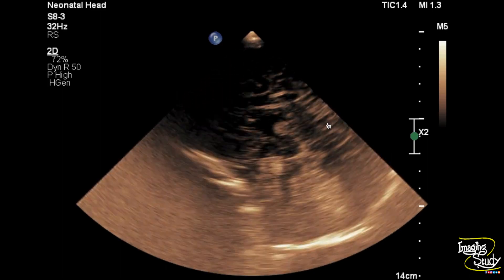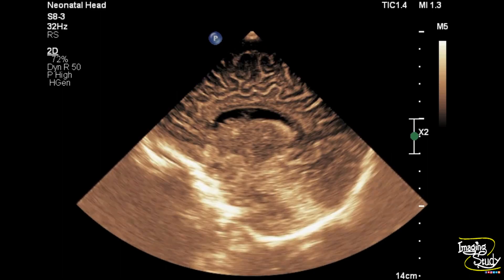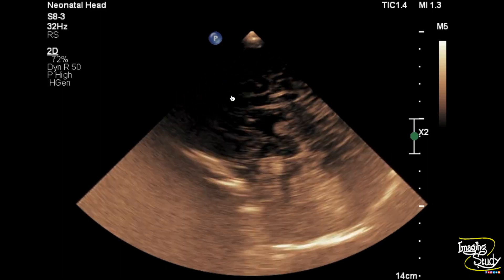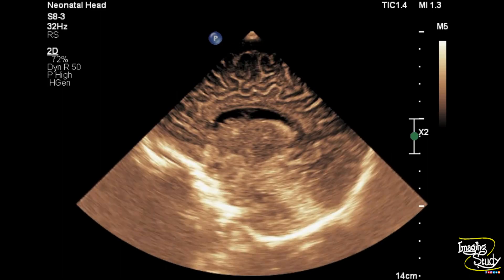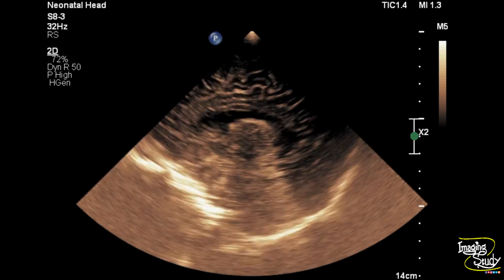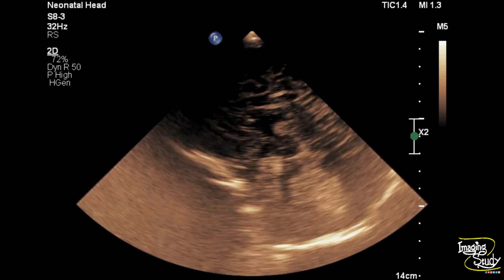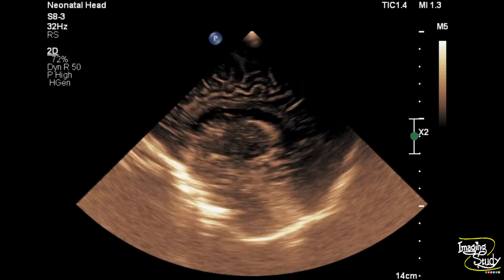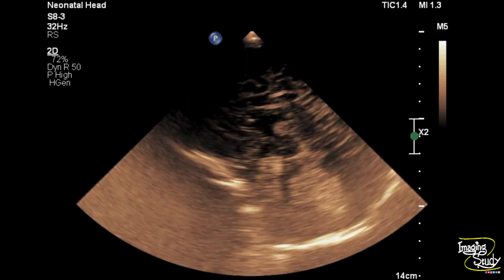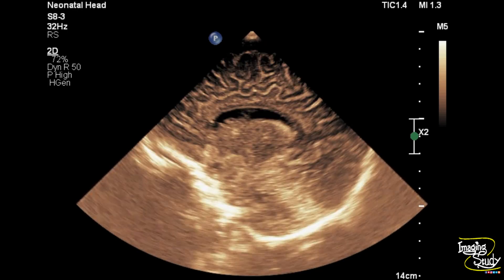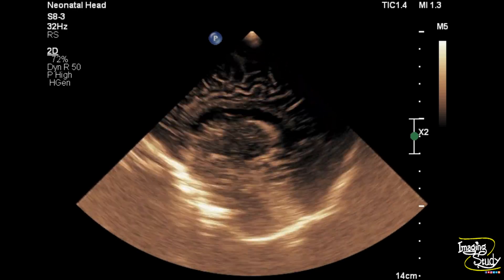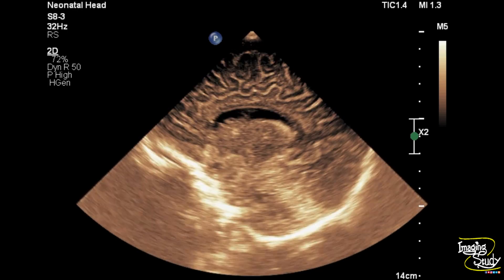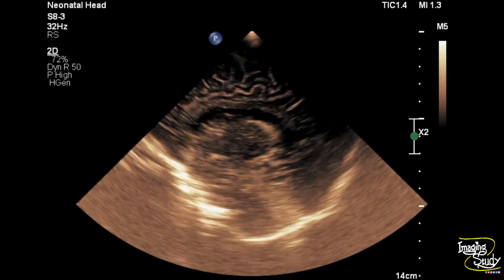Here you can see the sagittal section of the pediatric brain. You can see the cerebral sulci look prominent. These prominent sulci and gyri took our attention. However, the superficial area could not be well evaluated with this transducer, so we will use the linear transducer later.